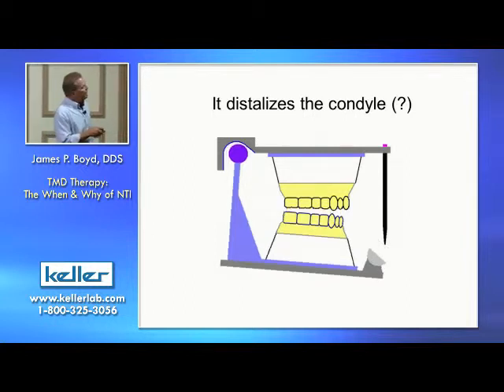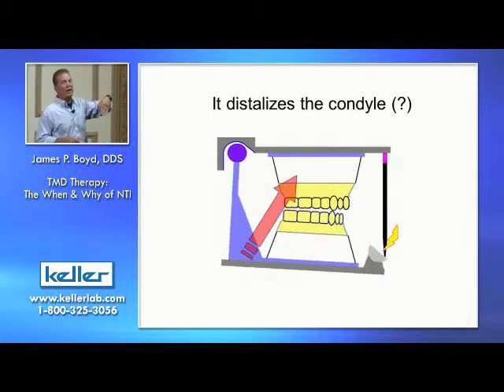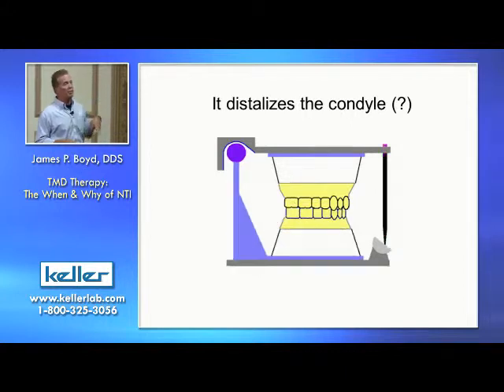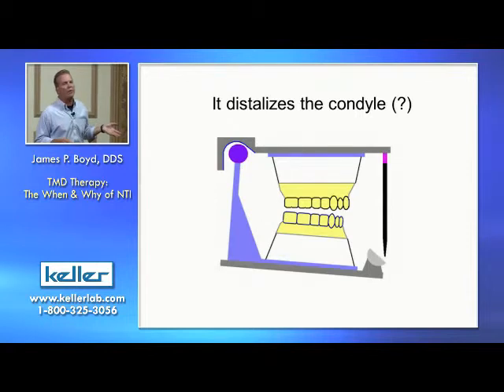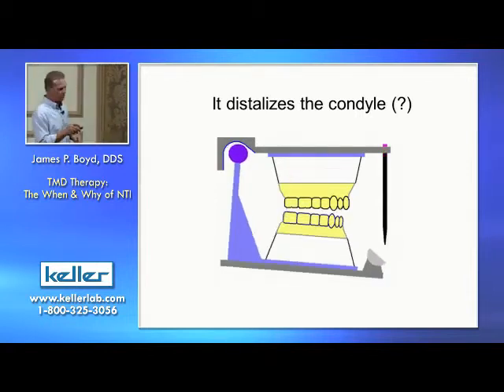Now, if you had an NTI device that was really weird and the patient bit down, it hurts their incisors, they will come back the next morning. If you didn't pay attention, they'll come back and their teeth are super sore because you didn't get it right. You didn't get the plastic perpendicular to the incisal edge.